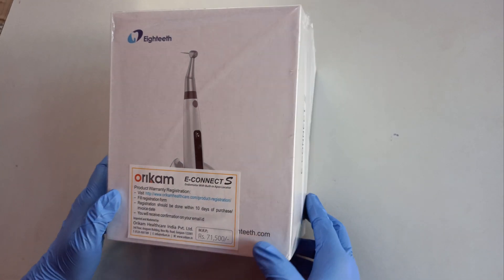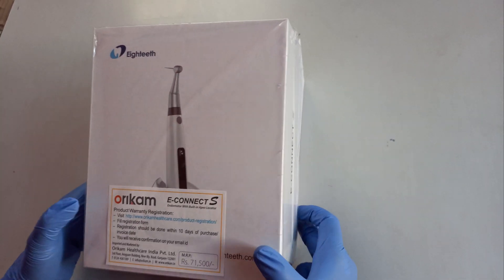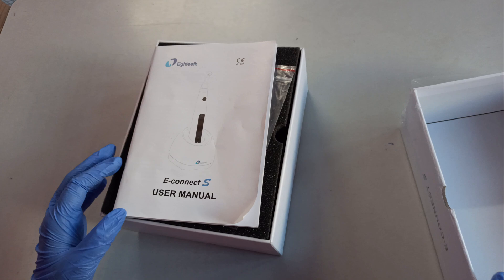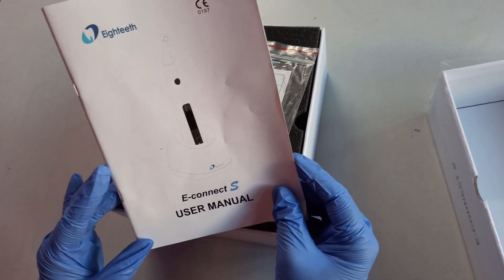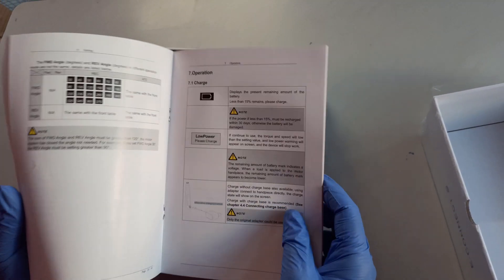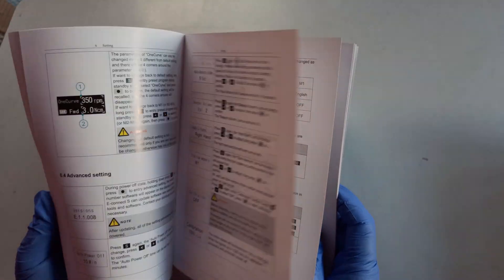This motor comes in a big white box with E-Connect S labelled on it. Let's unbox it. Inside the box, you will find an E-Connect S user manual with information about all the parts and functioning of the motor.